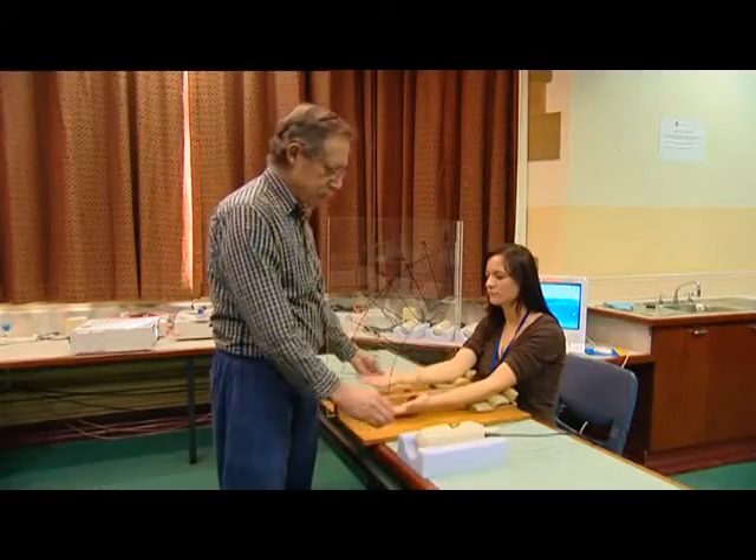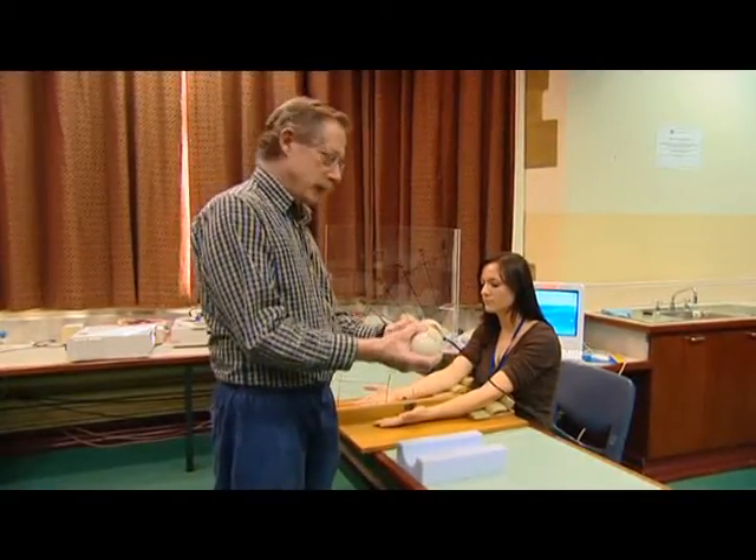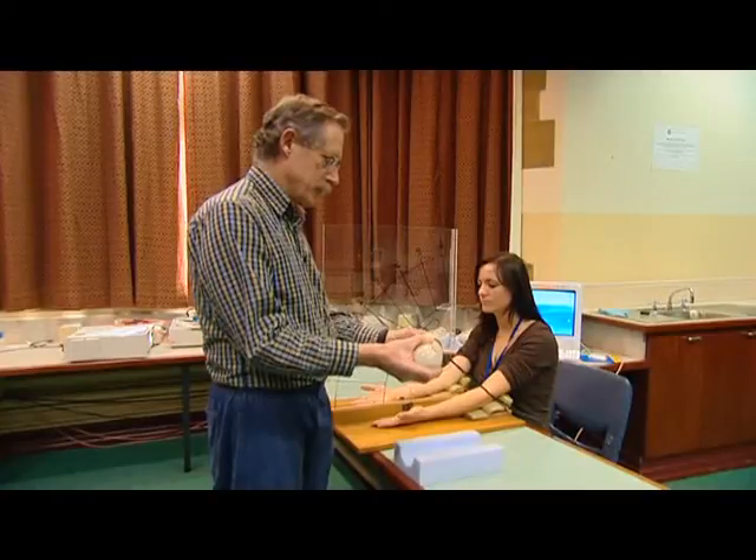One of our classes here is on reflexes. Reflexes are simply hardwired functions within the body where a certain stimulus is applied and something responds. The particular one we're looking at is the classic tendon or knee jerk type of reflex, where you tap the tendon with a hammer and get a contraction of the muscle. Now we'll repeat that but use the massage unit to stimulate the tendon and her biceps muscle.